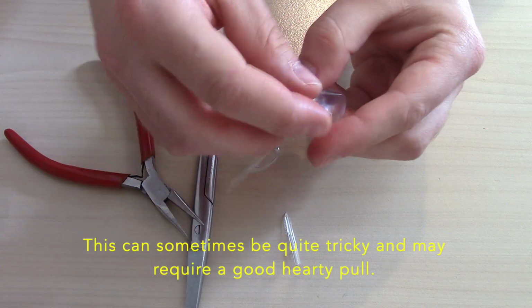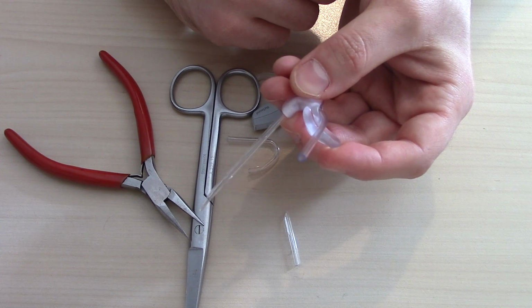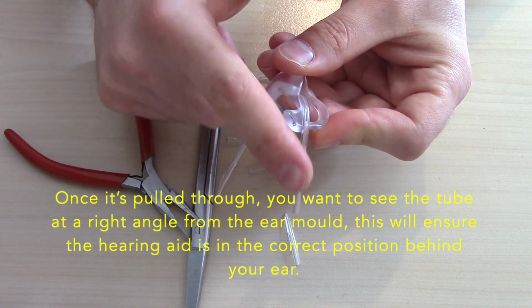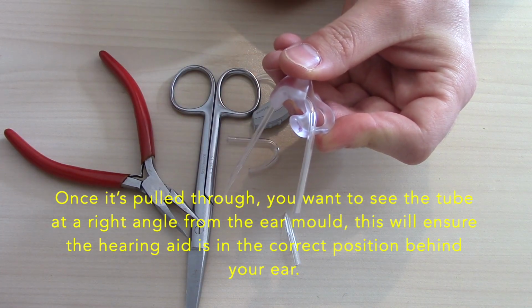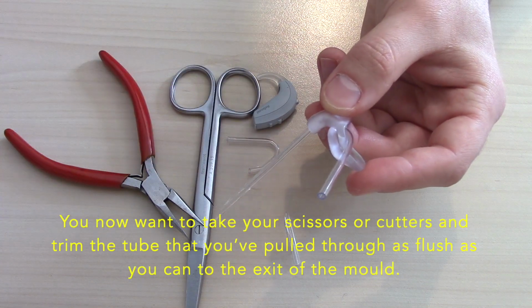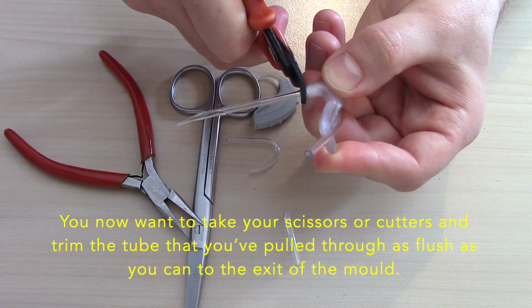This can sometimes be quite tricky and may require a good hearty pull. But once it's pulled through, you want to see the tube at a right angle from your ear mould. This will ensure the hearing aid is in the correct position behind your ear. You now want to take your scissors or cutters and trim the tube that you've pulled through as flush as you can to the exit of the mould.